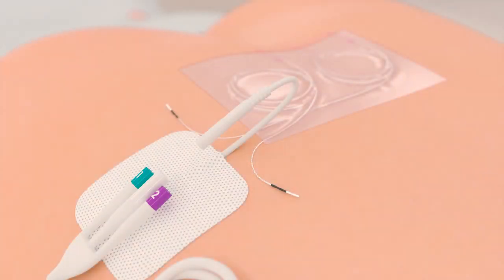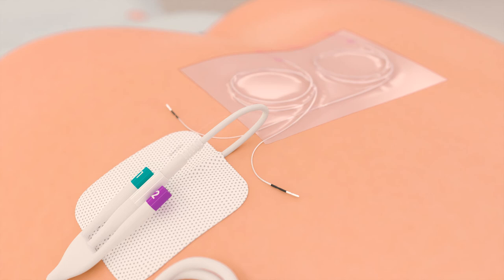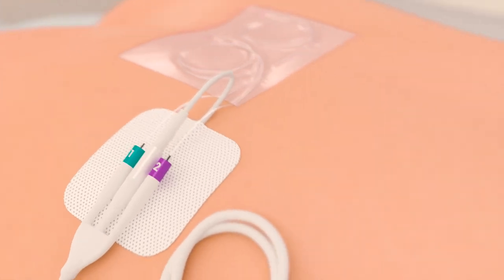The ground pad is connected to the basic trial cable and placed on the patient's skin near the lead dressings. The left PNE lead is then connected to the teal port labeled number 1 and the right lead is connected to the purple port labeled number 2.